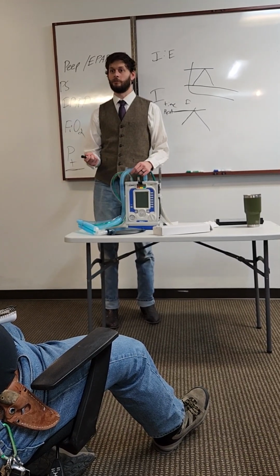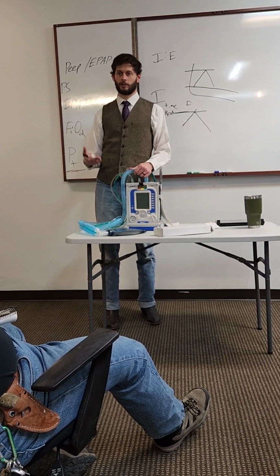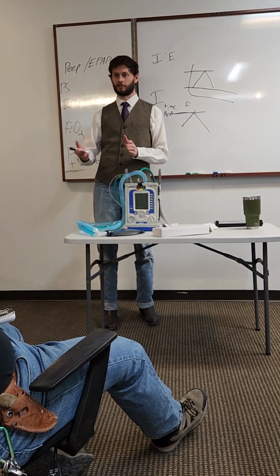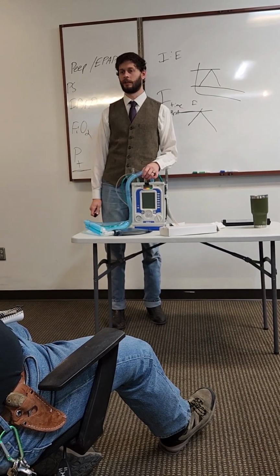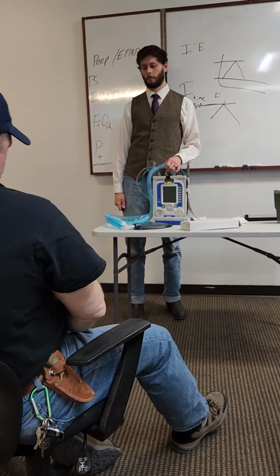So with a pediatric patient, you might have something like a toddler or something like that. Right. They're going to be breathing less than a tidal volume of 300. In that case, you need a pediatric circuit, so they can deliver that lower. So he's gonna have a smaller tube. Yep. Okay. Yep. How do you do the circuit check?